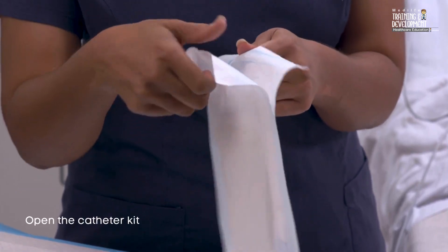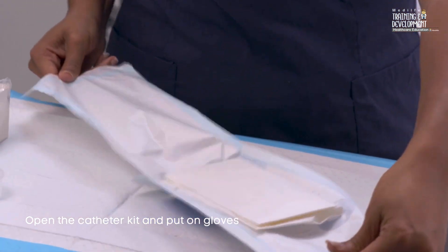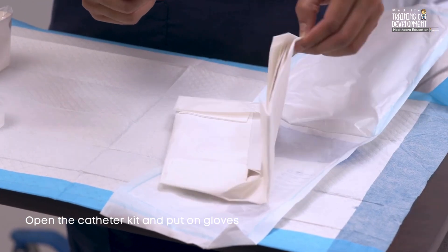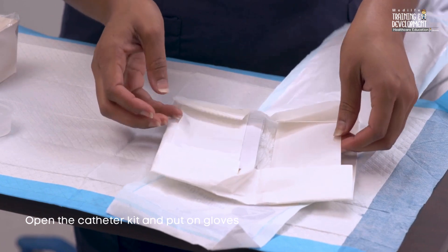Using sterile technique, open the suction catheter kit and put on gloves. If using individual supplies, open the suction catheter and the gloves, then put on the gloves by first placing the non-sterile glove on your non-dominant hand and then placing the sterile glove on your dominant hand.